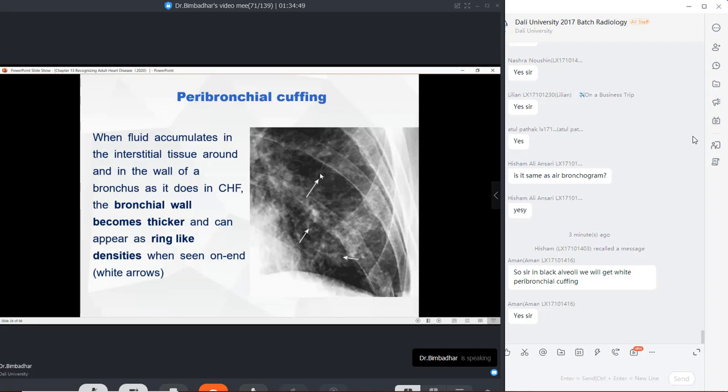And you see here in this patient, there is a very peculiar finding, but it may not be really apparent. There is a thickening of all the interstitium. You see here, the bronchus technically became so visible, right? So this is actually the first interstitial edematous pattern, and generally it happens along the hilar spaces. So perihilar opacities, patchy opacities, an interstitial pneumonia-like pattern coming down along the hilum is technically a characteristic feature of pulmonary interstitial edema. That's what we learned in the respiratory system as well, right?